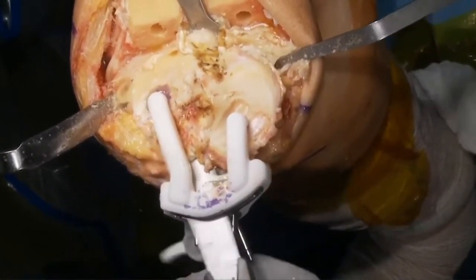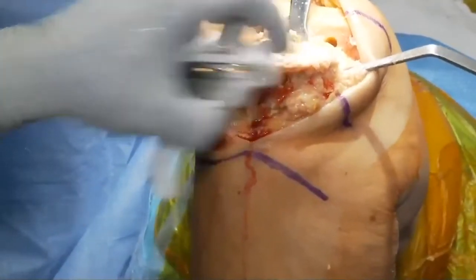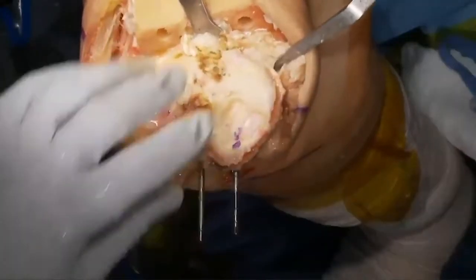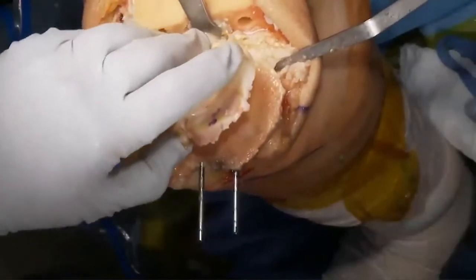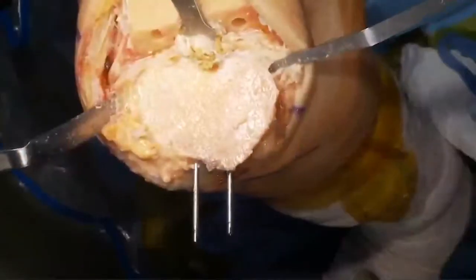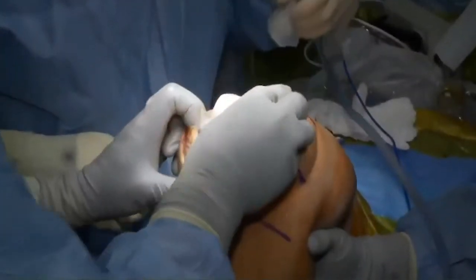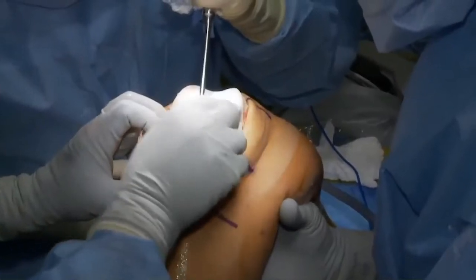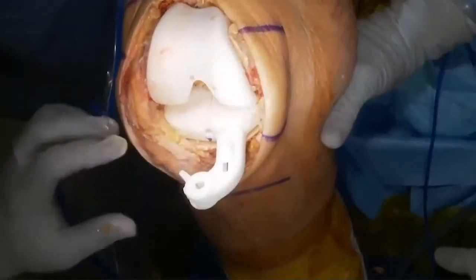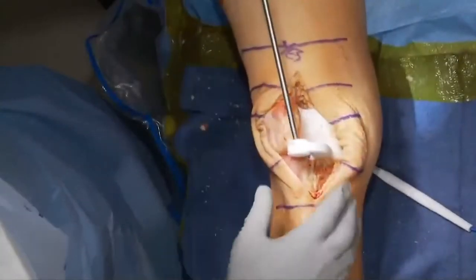For those who are fans of the ballistic nylon guides, they will come with the set — you don't have to special order them and don't have to use the metal cutting guides. If that's the technique you've developed and honed over months and years, you can continue it. We've just done some value-added additions. We've prepared the top of the tibia and now we're going to do some trialing. Osteophytes and menisci have been removed. For CR knees, I palpate the PCL and the collaterals. My assistant holds the bone hook up at 95 degrees, and I should be able to just glide the tibia in. If I have to push it, that's traditionally ended up in a knee that's too tight.